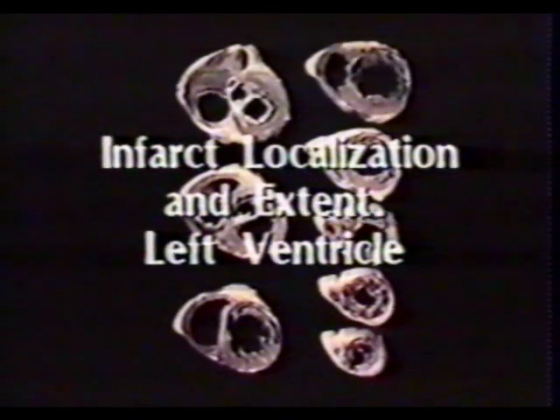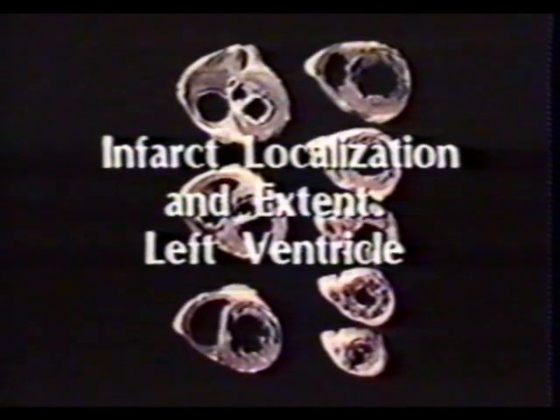As in previous tapes, pathology slides have been provided by our cardiac pathologist, Dr. William Edwards.